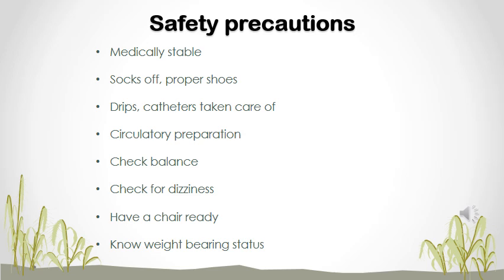Always ask them to open their eyes when they stand up, because you can actually pick up in their eyes if they are just about to faint, so that you can immediately tell them to sit back down. Have a chair ready, or even ask somebody in the close vicinity, if you are concerned, to be ready to bring you the chair that you have placed close by.